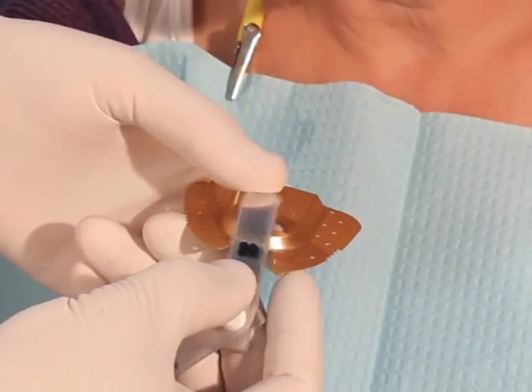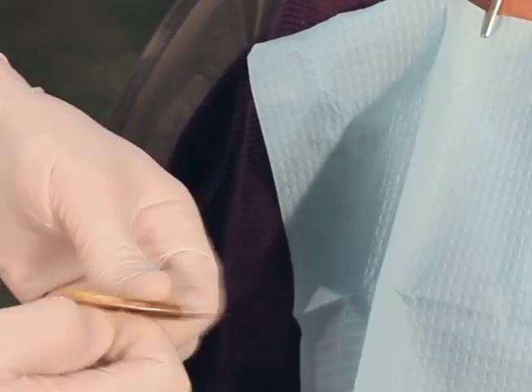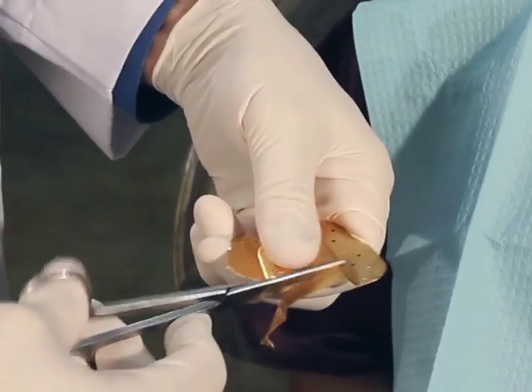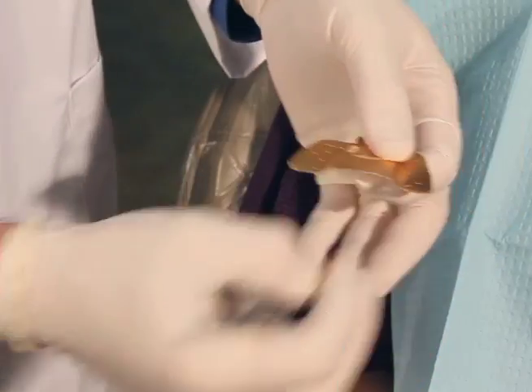Now we can use this with a leaf gauge or a Lucia jig and take a centric relation record. But we're going to use our recommended method which is a lower compound jig. In doing that, what we want to do first is size the tray. We can cut this back just distal to the first molar. It's a dead soft aluminum which makes it easy to cut.